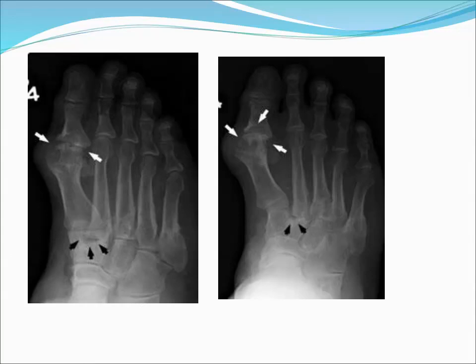Radiographic manifestations include: 1. Punched out erosions with sclerotic borders, mouse bite appearance. 2. Overhanging edge of cortex. 3. Joint space preservation. 4. Asymmetric polyarticular distribution. 5. Normal mineralization. 6. Tophi, soft tissue masses that may or may not calcify, in long-standing disease.